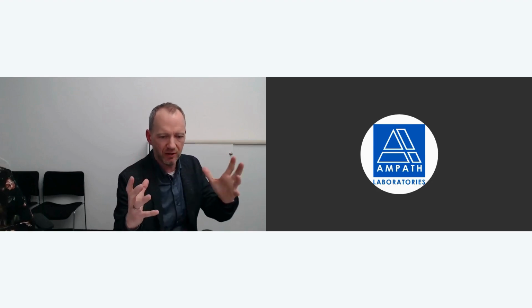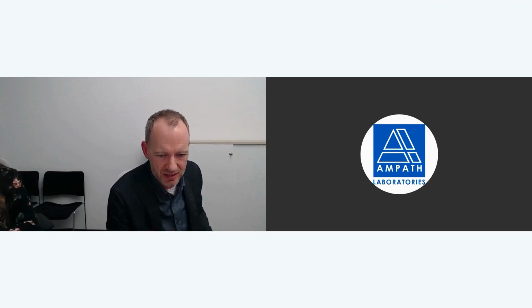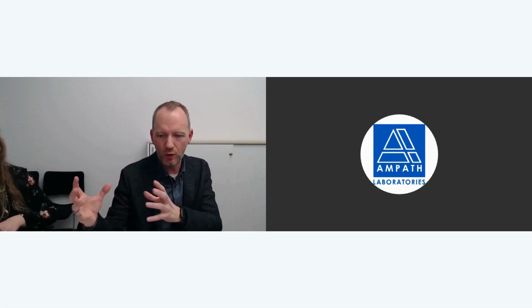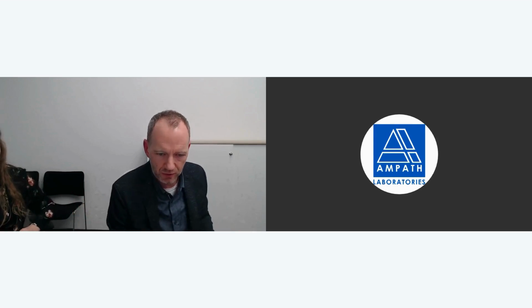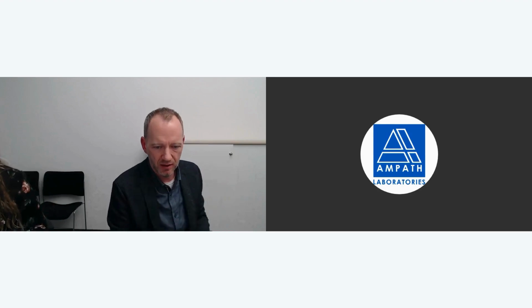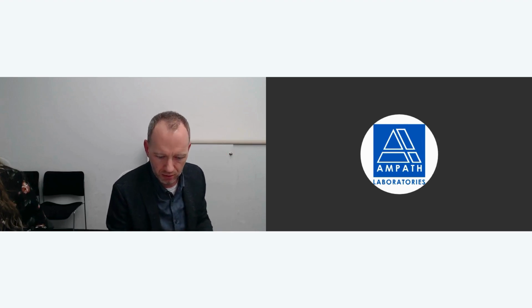Obviously, it's important to remember that the Alex3, just like any diagnostic test, or any sIgE test, is detecting sensitization as opposed to allergy. You always have to take the patient's clinical picture together with the actual test results to make a proper diagnosis. But the Alex provides a more broad picture in one single step.